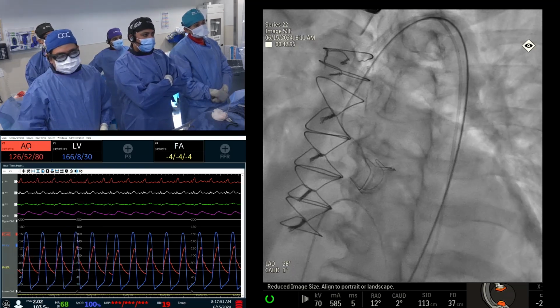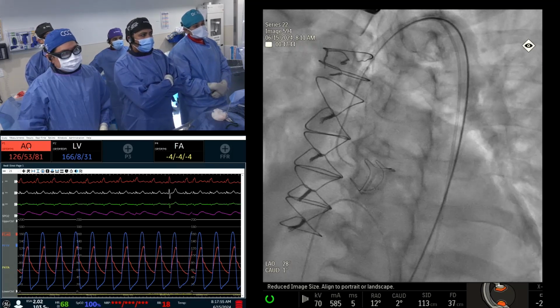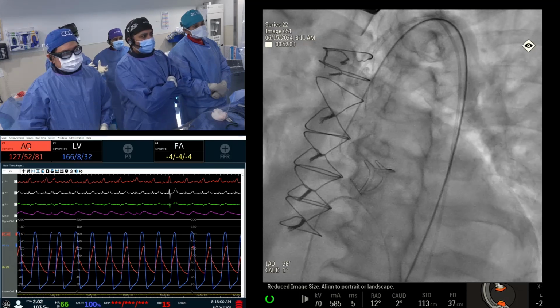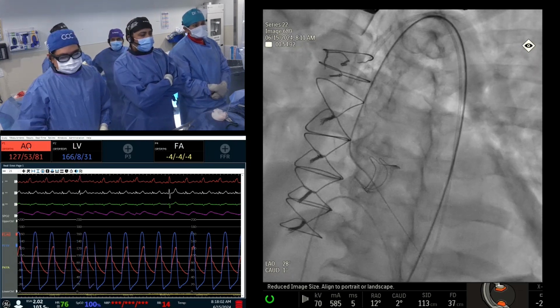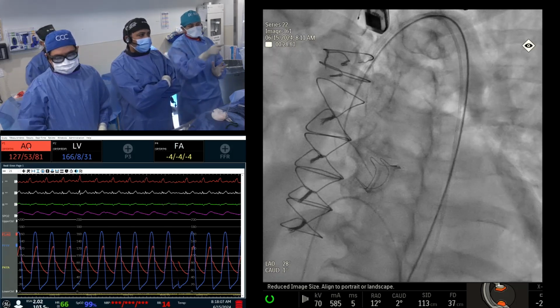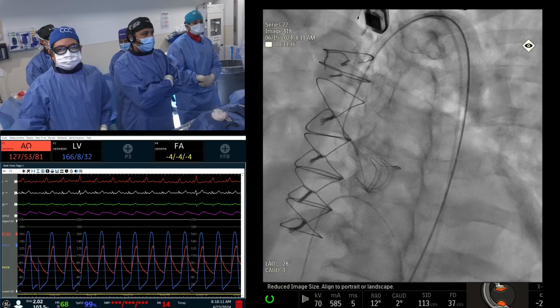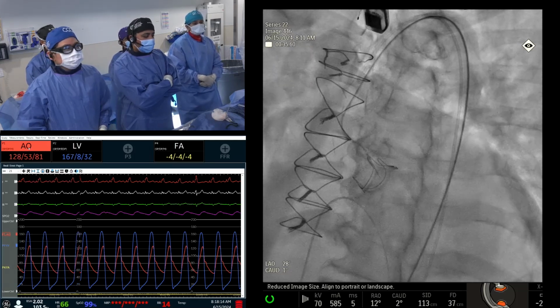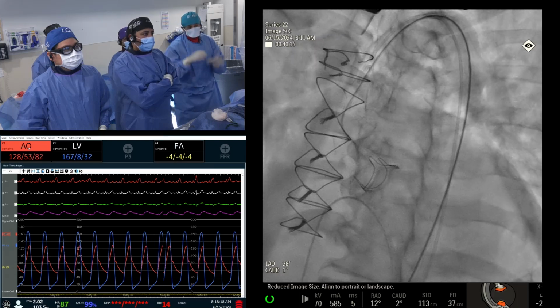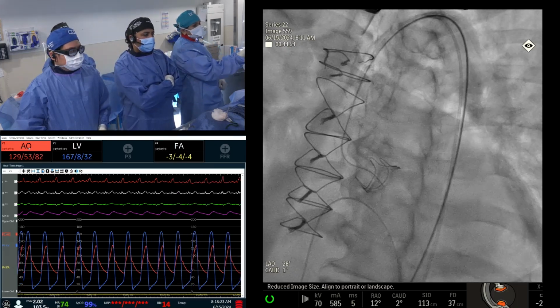So did you use AR2 or AR1? Here we have to use AR2. I see. Okay. Dr. Kinney, can you comment to the audience about a large aortic root with a small prosthesis? What are your tricks? So ideally it would be AR1, we went to AR2, and then you have to keep rotating. You see that? You have to go to a view where you can see the center of the valve. Ideally, I said RAO would be better, but in this case, RAO would not.